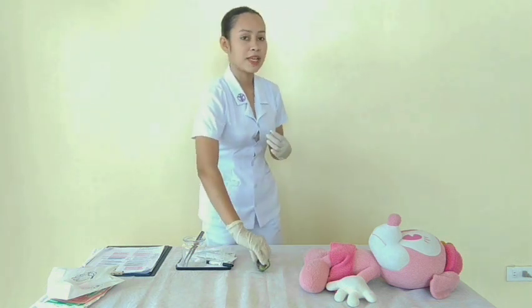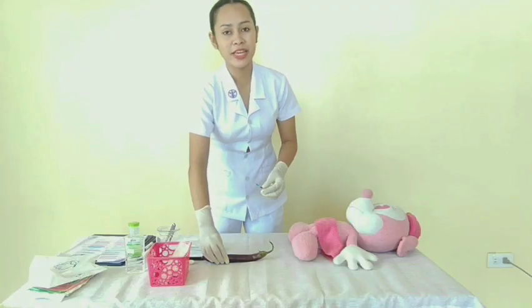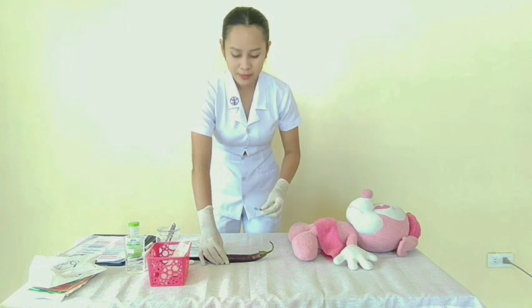With my non-dominant hand, hold the skin at the site until it is taut, and insert the tip of the needle far enough to place the bevel through the epidermis until the dermis. And inject the medication carefully and slowly so it will produce a small wheal on the skin.